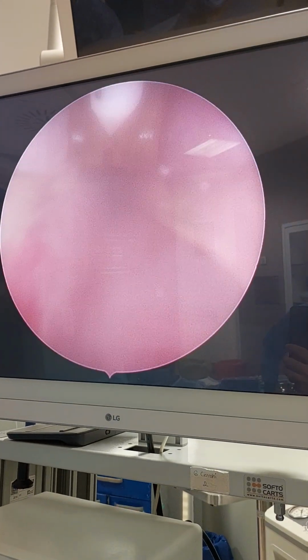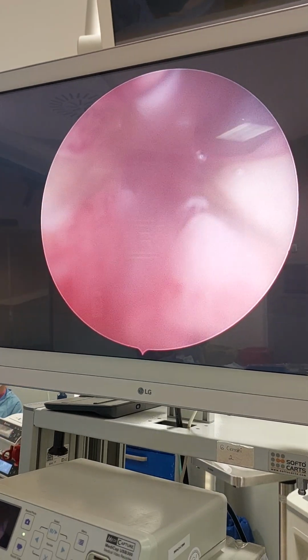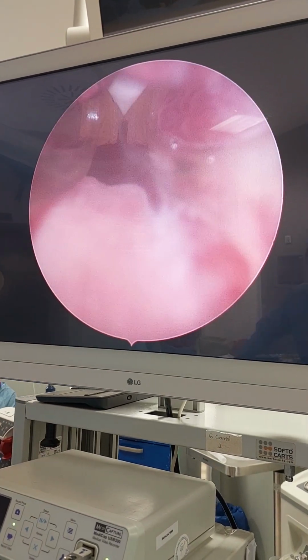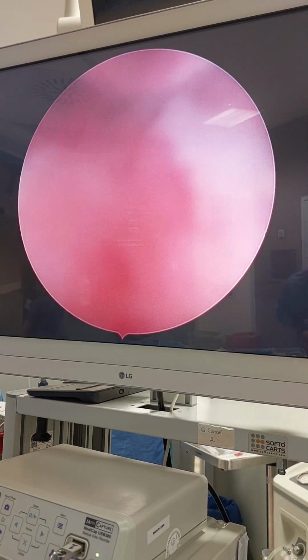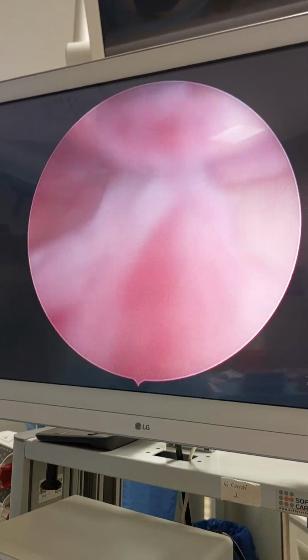Okay, look at this inflammation. It's coming from these parts of the prostate. You see? So normally, with the resectoscope, the instrument that we use for TURP or Holmium, the irrigation is better and I can show them better, but also in this case we are lucky to see these inflammations. Normally the Rezum instrument is tiny and you can see the prostate very nicely. So I want to drain all of them. It's really sometimes difficult, but I have to spare some time here.